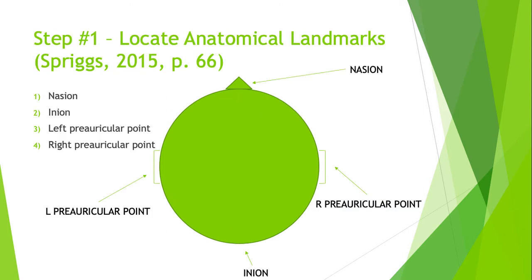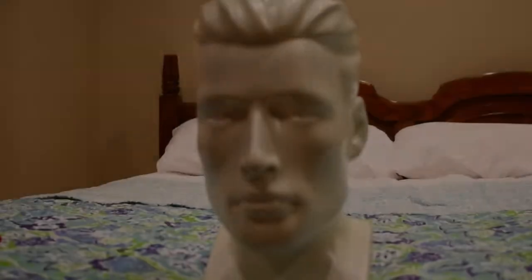What follows are the 6 steps to completing a standard polysomnogram hookup through utilizing the 10-20 system. Each following step after step number 1 will be preceded by a corresponding video, and the slides will serve as a brief review. First, we will locate our 4 anatomical landmarks.